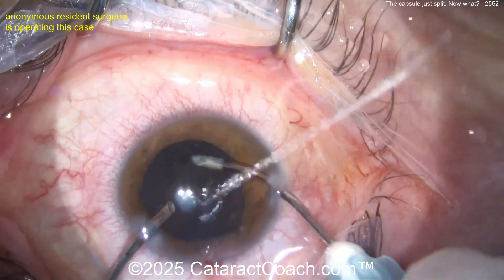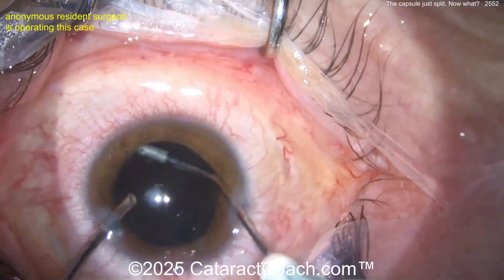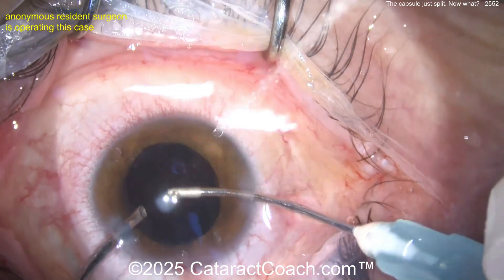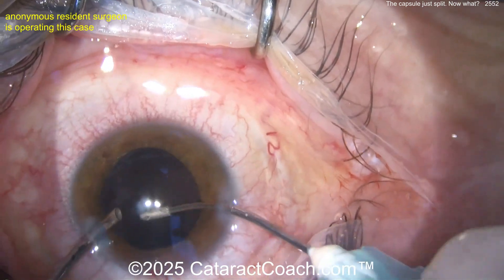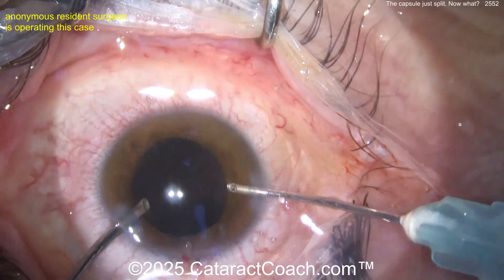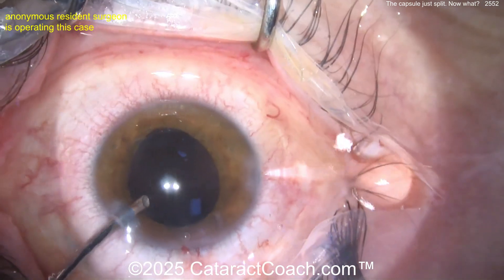Going inside the eye again — let's clean up that central dot. What is that central dot? We've sped the video up so we can get through it in a timely manner. Get that central dot — that's what's going to affect the patient's vision for sure. Don't worry so much about the periphery and the lens equator capsular bag. That central dot is what we want to worry about.